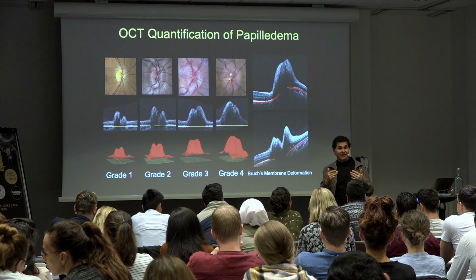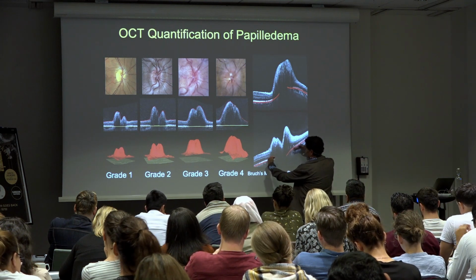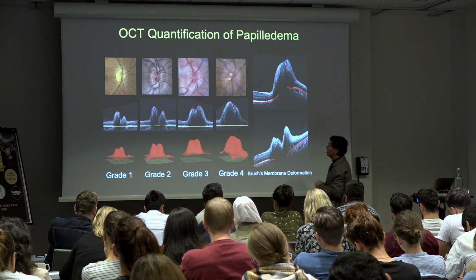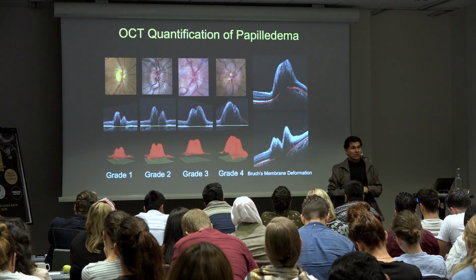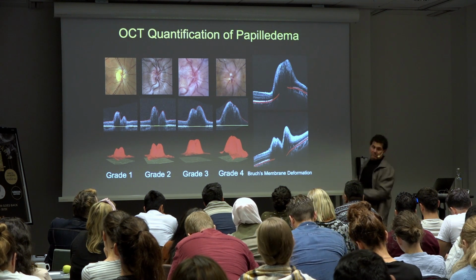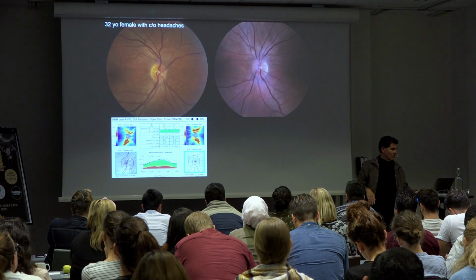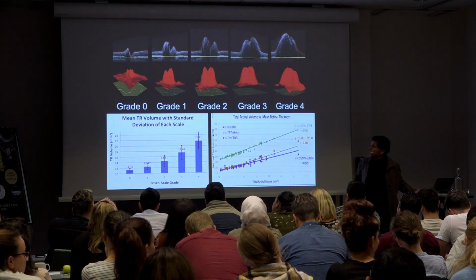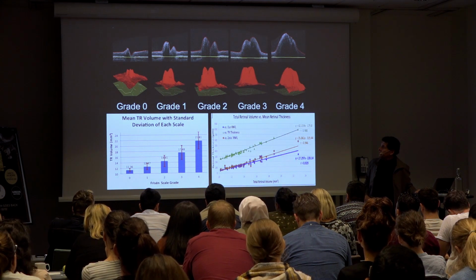So that's a sign that there's raised intracranial pressure, as opposed to the normal configuration, which is neutral or pointing backwards, especially in glaucoma, pointing backwards. And sometimes this is helpful for following patients. So Bruch's membrane, as the pressure comes down, Bruch's membrane deformation will become less. And this is just showing the use of volume, which is very robust, even when the nerve fiber layer fails.